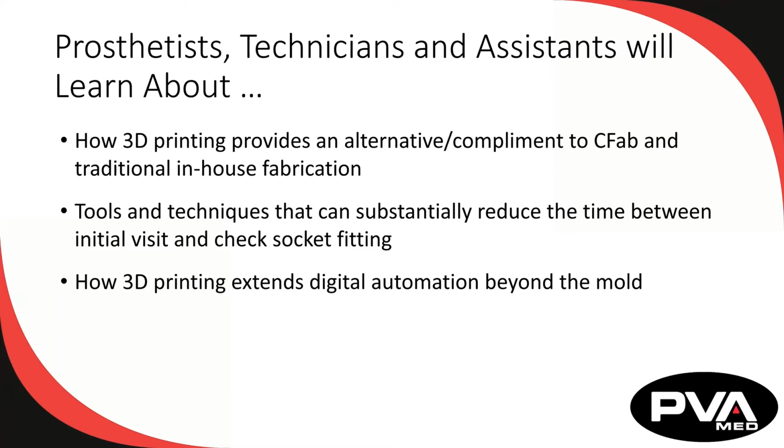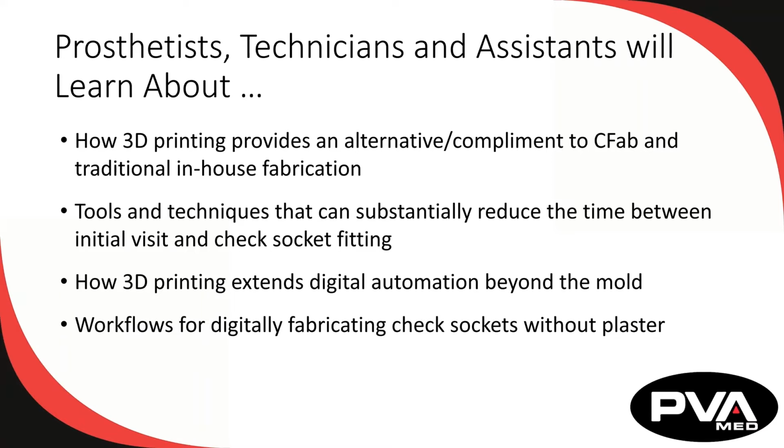Participants will learn how 3D printing extends CAD/CAM and automation beyond creating a foam carved mold to be used in a traditional fabrication of a check socket to actually creating the check socket device to be fitted automatically. We'll also cover digital workflows that enable check socket fabrication without the need to mix, pour, or sand any plaster.